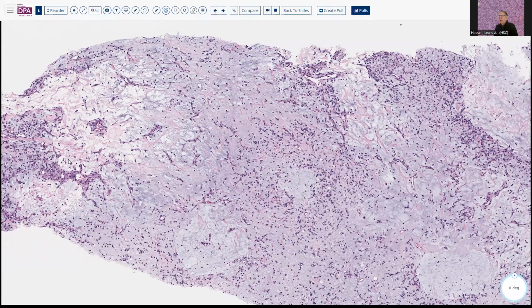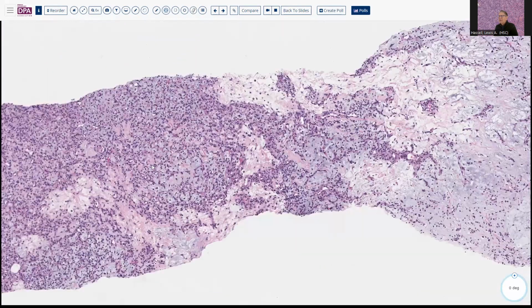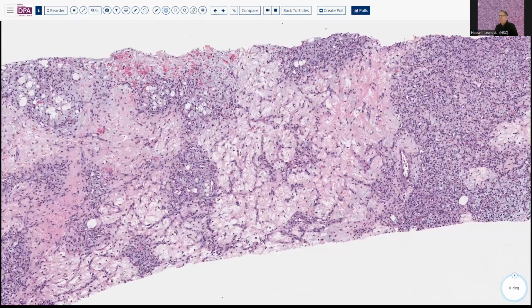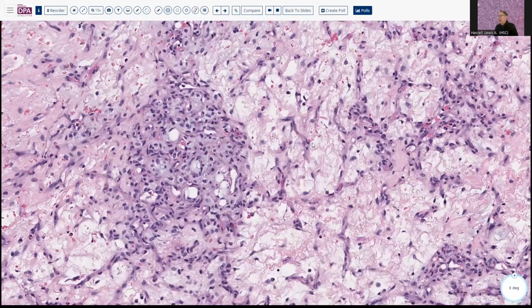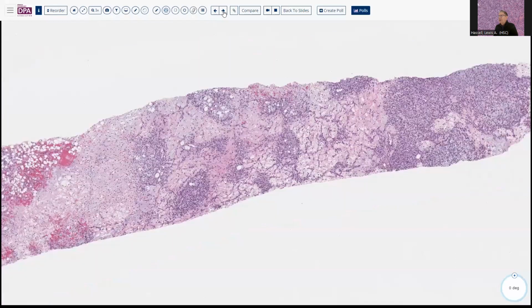So recognize that this is one of those myxoid neoplasms that may only have lipoblastic expression in certain areas. And as you see in this core, we go through several millimeters, if not centimeters, before we come to this area where we have characteristic lipoblasts that would suggest the more specific diagnosis. So just a nice instructional point there about the distribution of the lipogenic component.